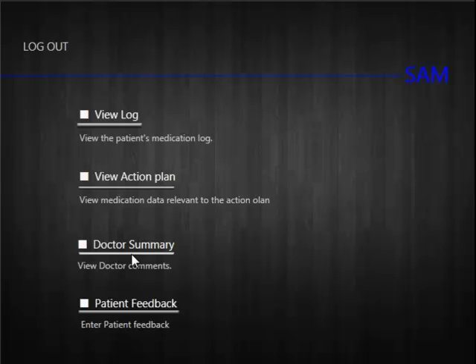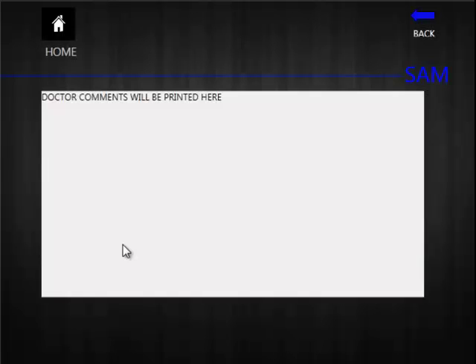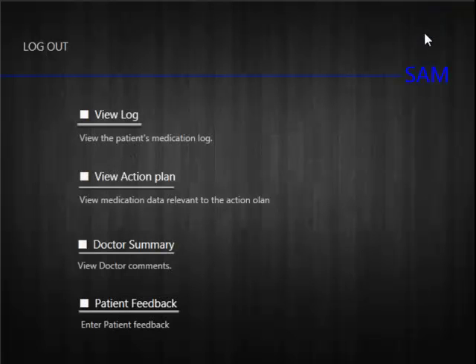And the doctor summary will allow the user to view the doctor's comments on the patient's progress and their medication patterns, what should be done and what shouldn't be done, what should be followed, and all that. Those comments can be viewed here. The doctor will submit their comments in their doctor's login.